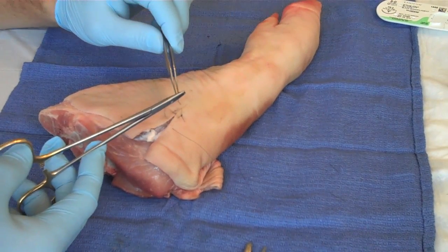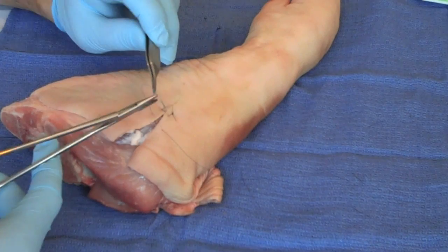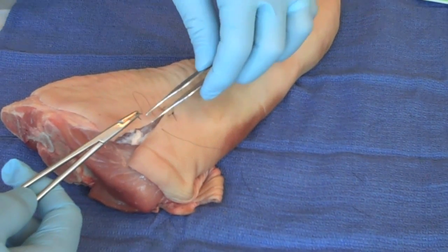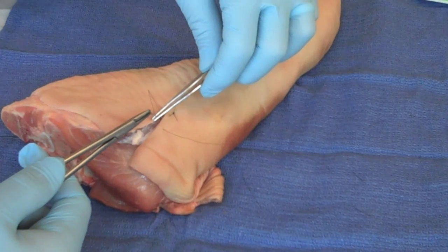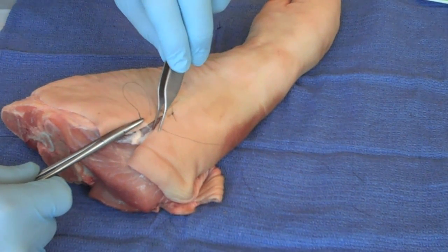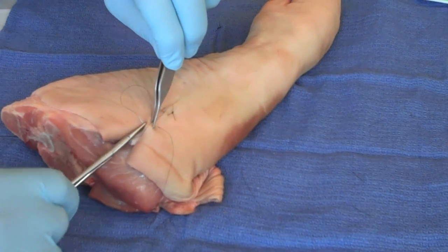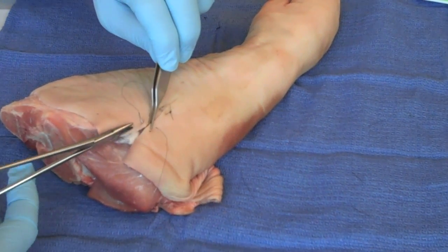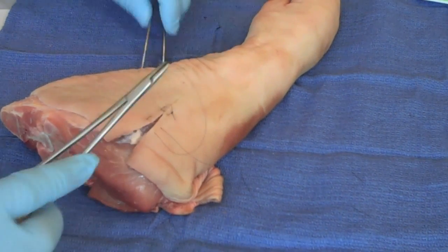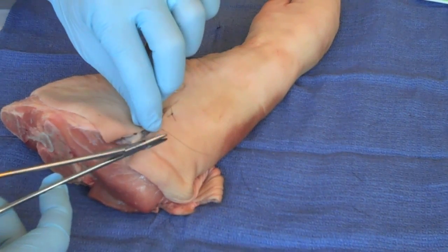Grab your needle — not grabbing the tip — load it backwards so you can take advantage of the natural curvature of the needle. When you twist your wrist as you drive the needle in, not push but turn, mindful of your planes. Wound edge eversion — turn, don't grab your tip — and simply do a tie.